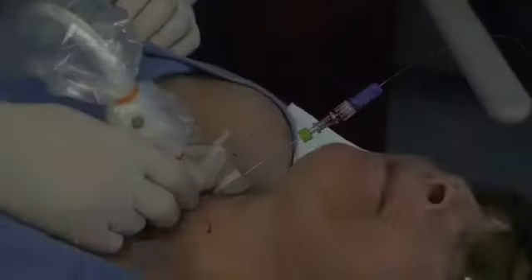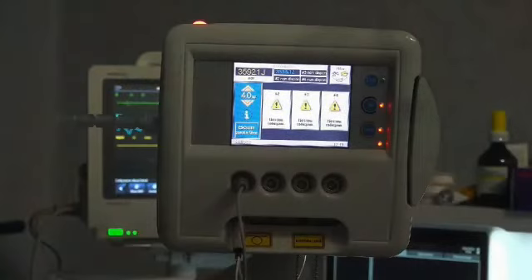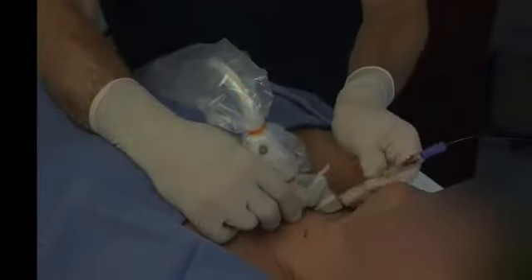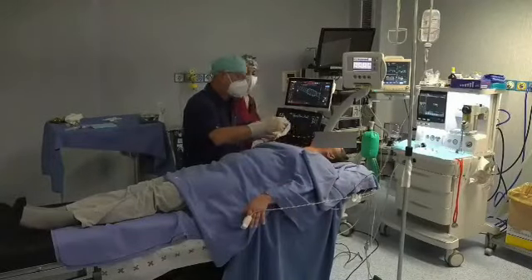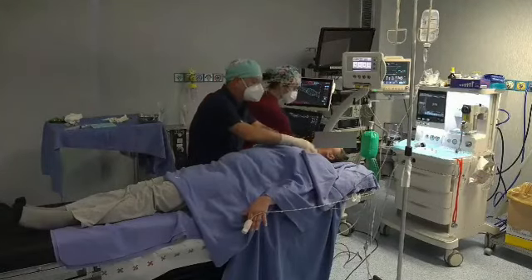During the procedure, the patient can speak without making any movements. It is evident that our patient did not feel any kind of discomfort. At the end of the procedure, the fibre is removed together with the guide needle. A transparent dressing is affixed, which allows for post-procedure ultrasound control, and ice.